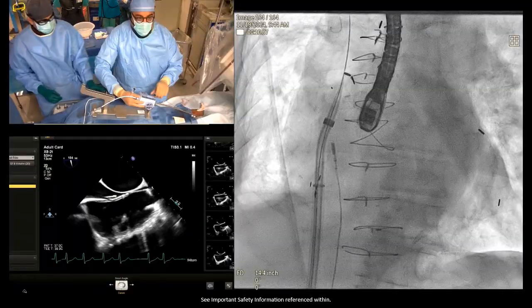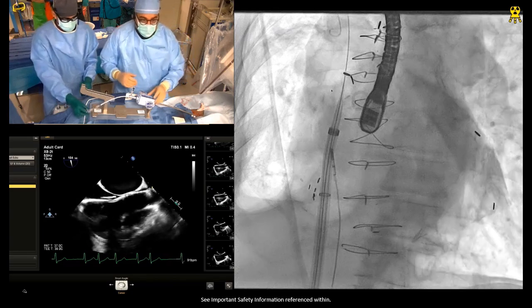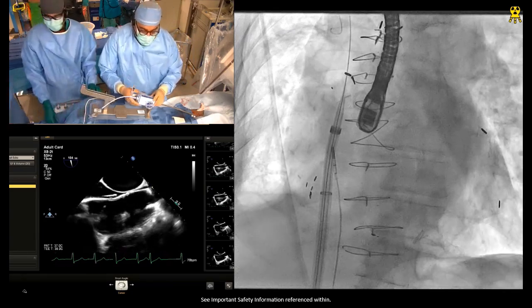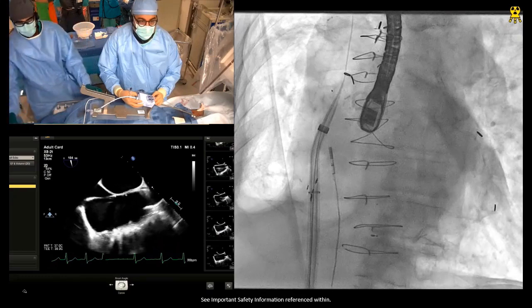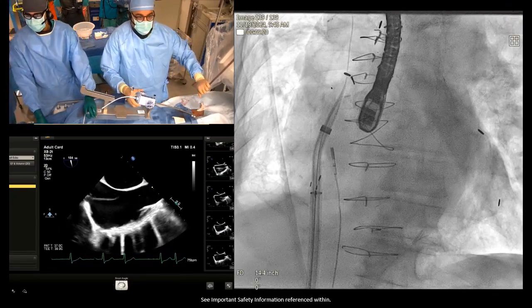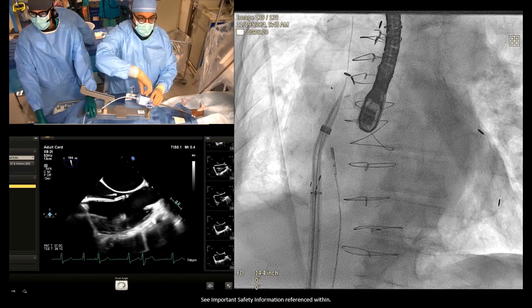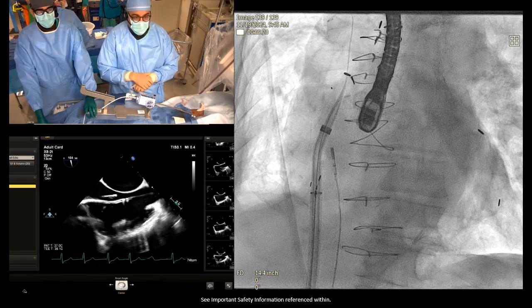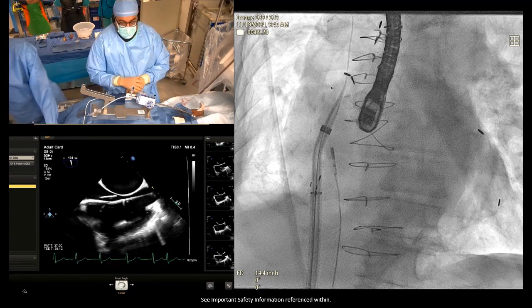Sounds perfect. I have a half turn negative on right now, so that definitely extends things. You see how I'm kind of hugging the septum a little bit? If I counterclockwise rotate, I want to see if that moves me away from the septum. See if you can find me there again, Edris. Move a little more posterior to find you. Didn't really, so I just did a little clock. So really it turns out I can either do more negative, and you see how that pulled me away from the septum. So I think this is probably a good place to start here, huh? Yeah, I agree. Okay, great.